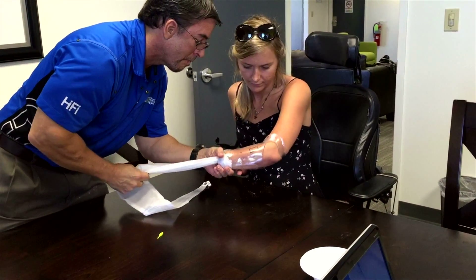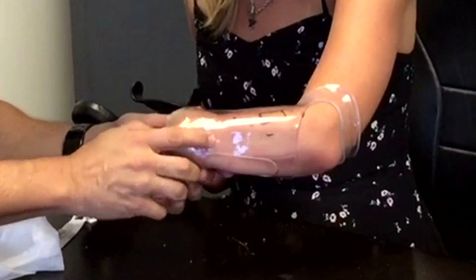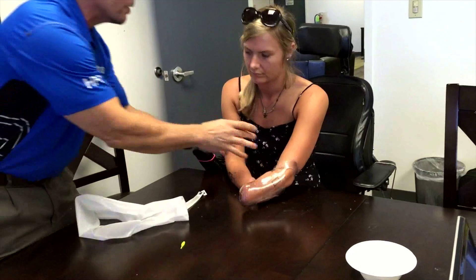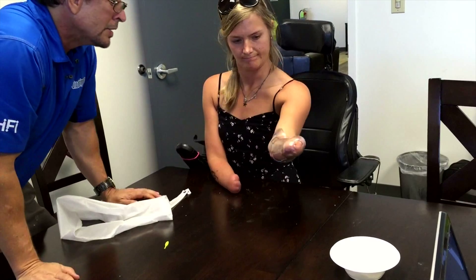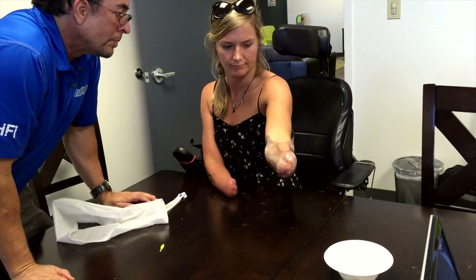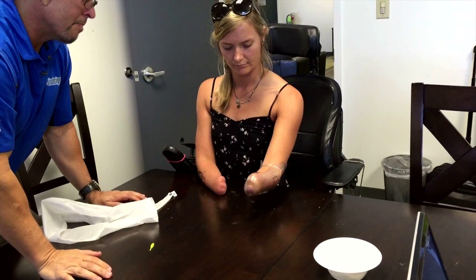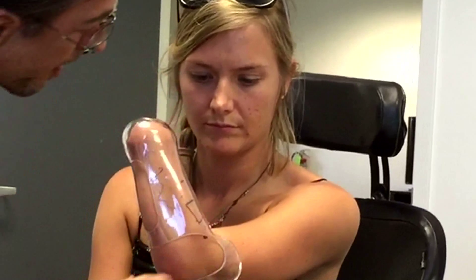That's so cool. I left you a little loose up here because I wanted to try to give you as much rotation as you can get. And what about if you're not moving your shoulder as much, just like down through your arm? Not bad. So we're going to capture more of this motion down and through here, attack a little bit more there.